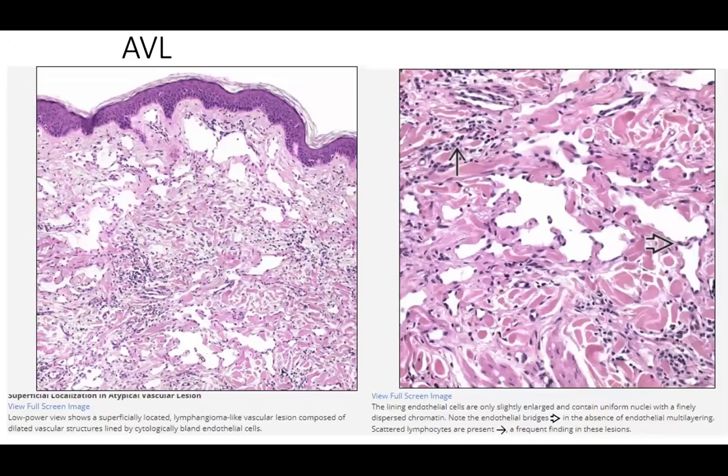More examples show the superficial location of the atypical vascular lesion and cytologically bland endothelial cells — lined by a single layer of endothelial cells that lack significant nuclear atypia.